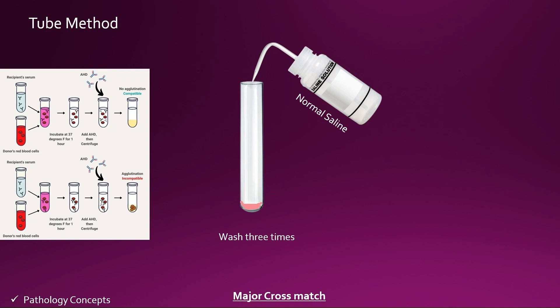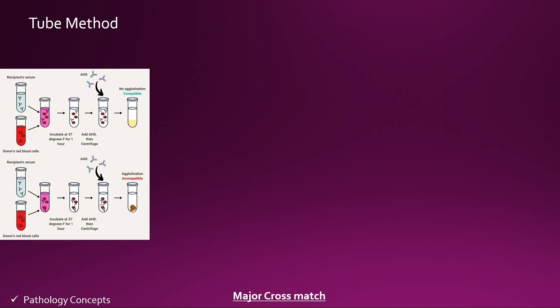If you find agglutination at this phase, it is called the saline phase and it detects the IgM antibody. But if you don't find agglutination, we can say that IgM antibody is absent. However, we still have to perform the AHG phase. After washing, add 2 drops of AHG into the tube.